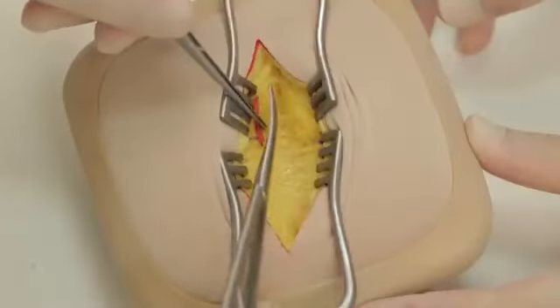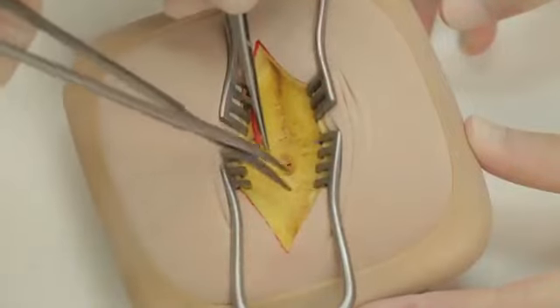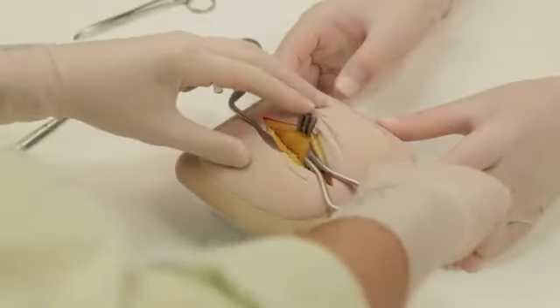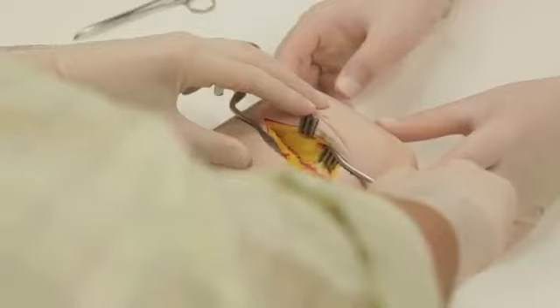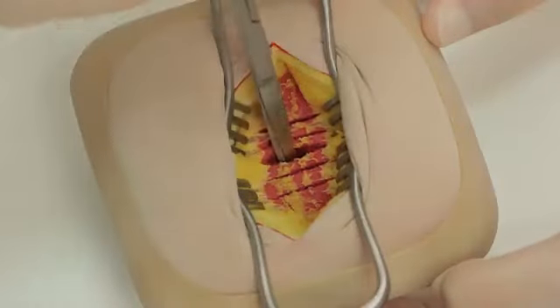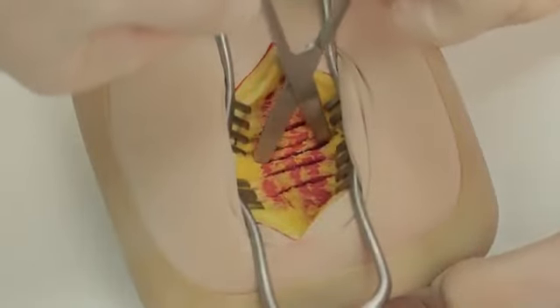Deepen the incision by dividing any connective tissue to expose the fibres of internal oblique. Again, reposition the self-retaining retractors so you have optimum view. Internal oblique should be split rather than divided by opening Mayo's straight scissors in the line of its fibres.